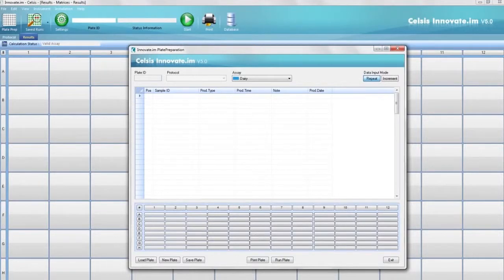Click on the plate prep icon. Enter the plate ID, protocol, and assay. Activate the wells that correspond to where your samples are in the plate. Then, enter the sample ID and other user-specified information.